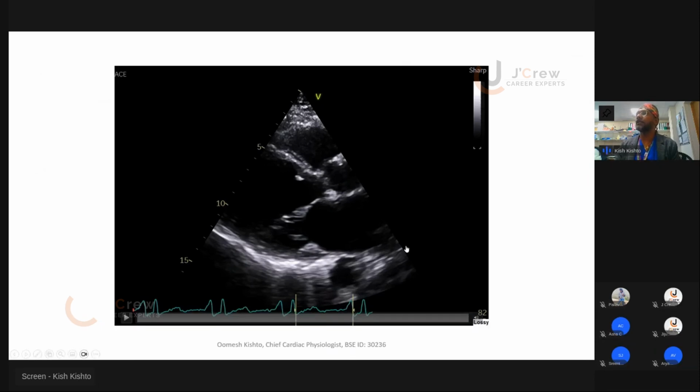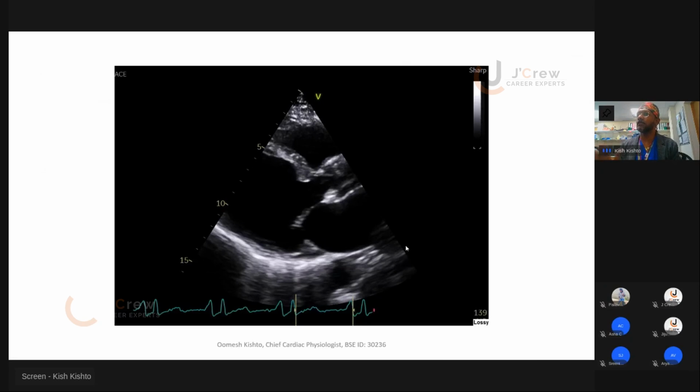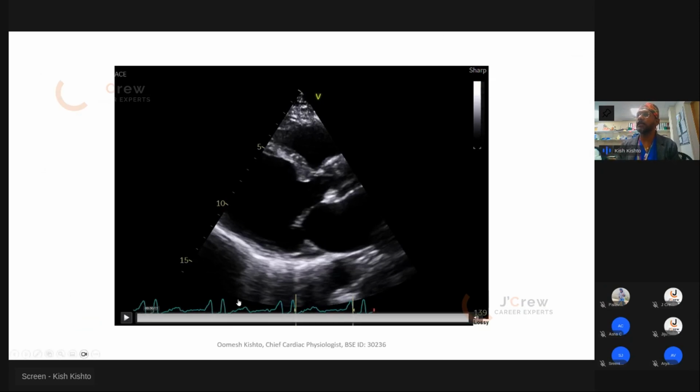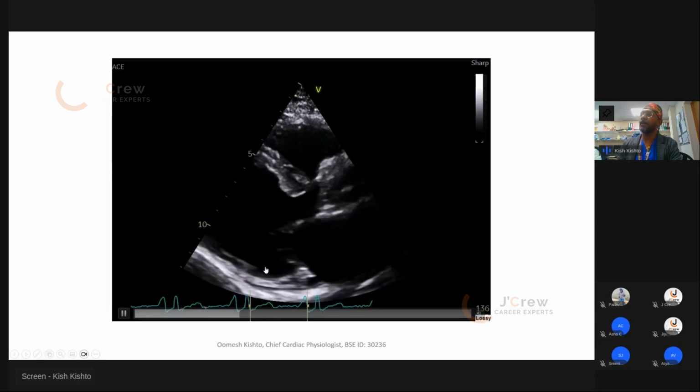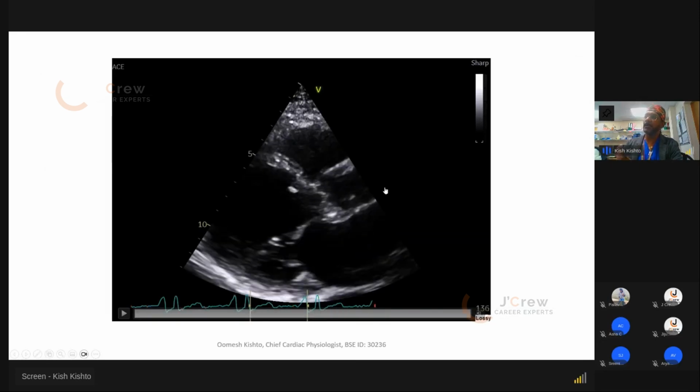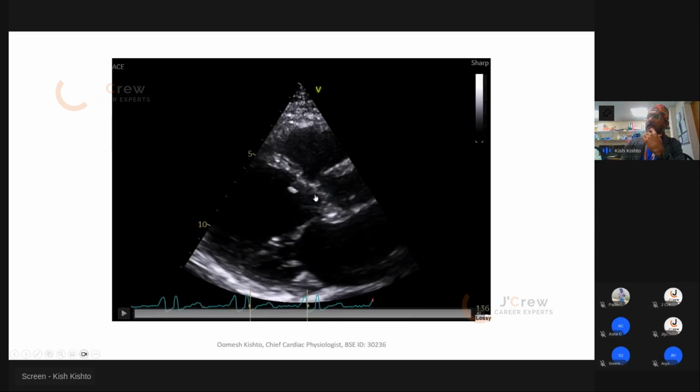And so again, I will do everything as routine. You can see this ECG is very weird. Look at the P wave there, massive. And optimize. From this image you can already see the LV dimension is quite dilated, and a sclerotic type of aortic valve.